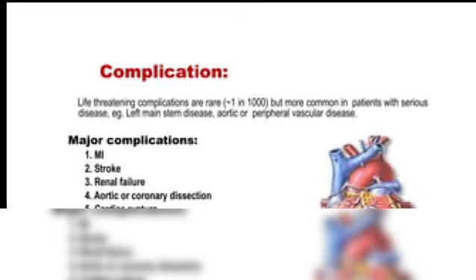After this procedure, we have to check some patient care. The patient should be asked to rest for a few hours. If the puncture site is on the femoral artery, the patient should lie flat, and we have to monitor the patient for any bleeding, pain, or reactions due to the contrast media. The patient can be discharged later based on the patient's recovery.